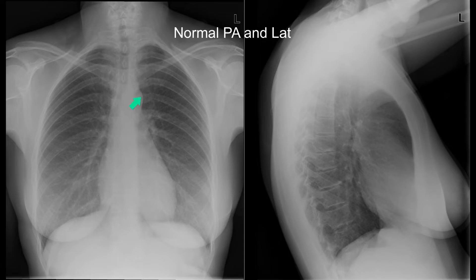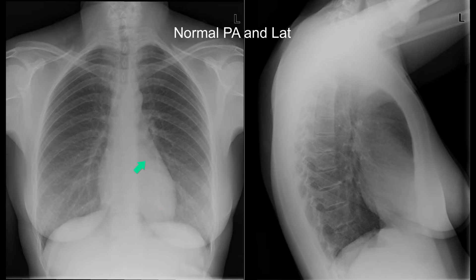Here's the aortic knuckle. Here's the pulmonary trunk. There's the left main pulmonary artery. There's the right main pulmonary artery. The left atrial appendage isn't seen on this study but is in this vicinity. Here's the left ventricle. The left atrium is posterior. The right atrium forms the right heart border.